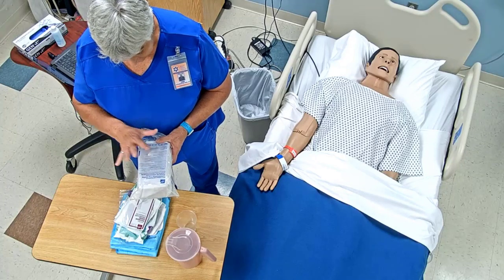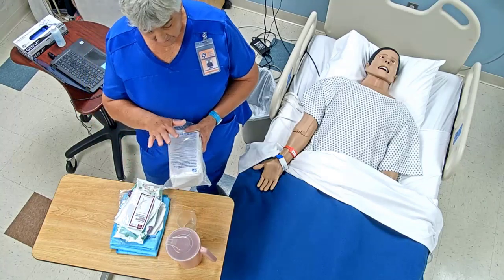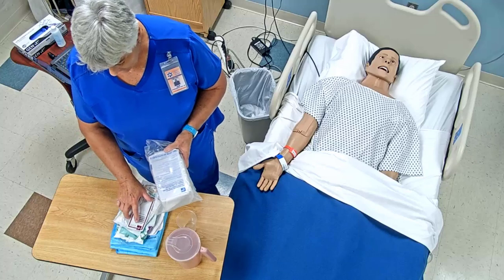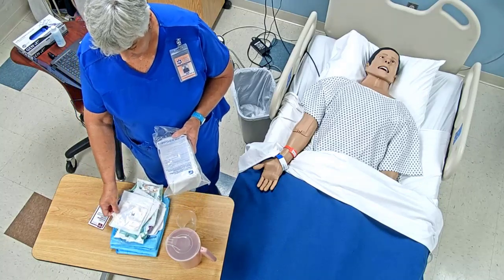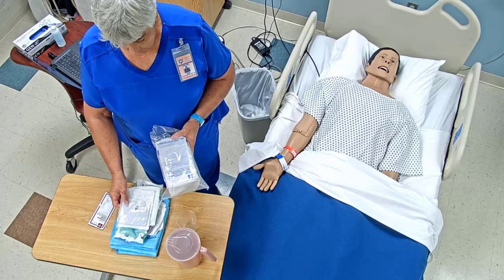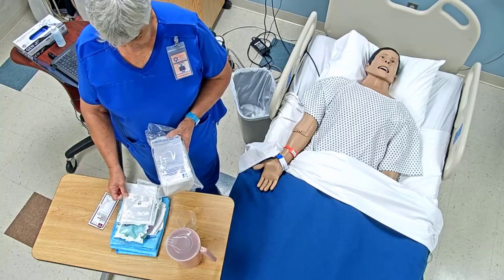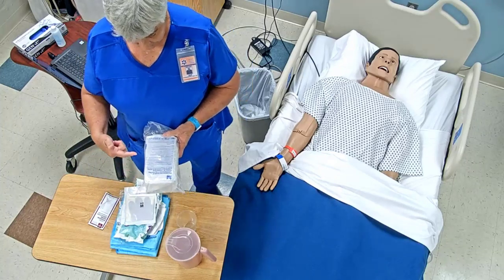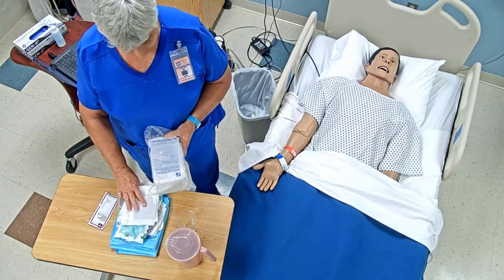Typically in these packages, they're medium gloves, so if you are not a medium, you do need to get different glove sizes. If you're small, large, or extra large, you would need some extra gloves in there, or just take one extra in case you contaminate the gloves that are in here. So always have extra gloves.